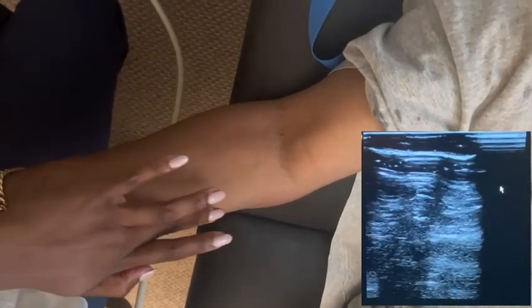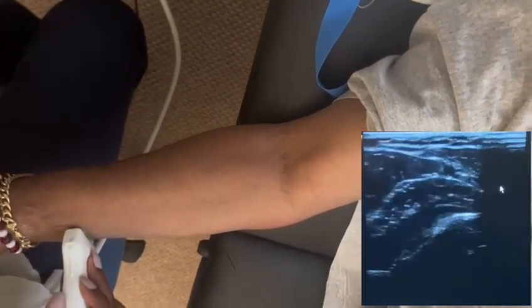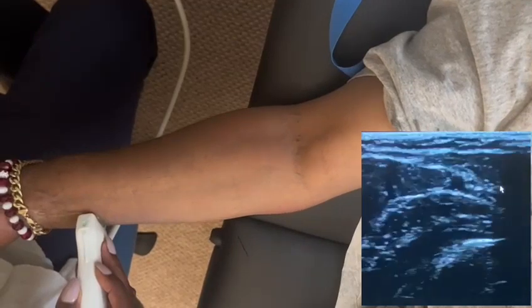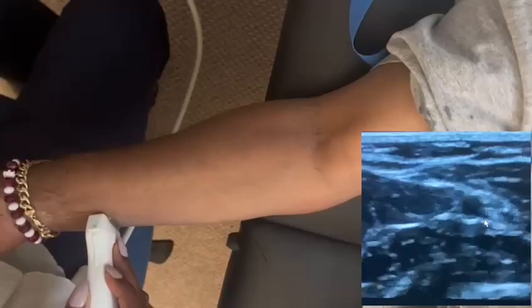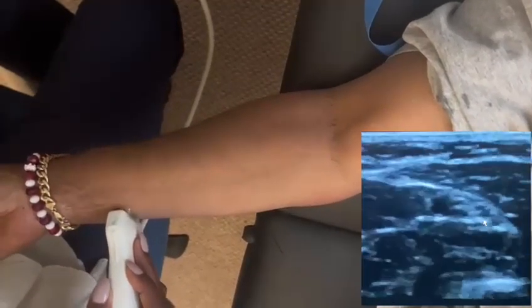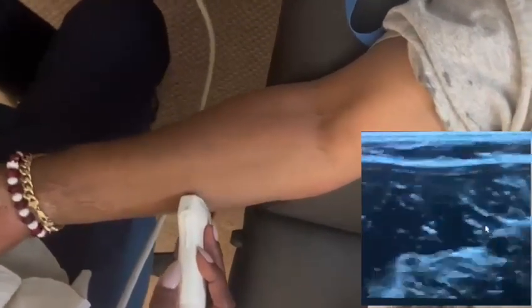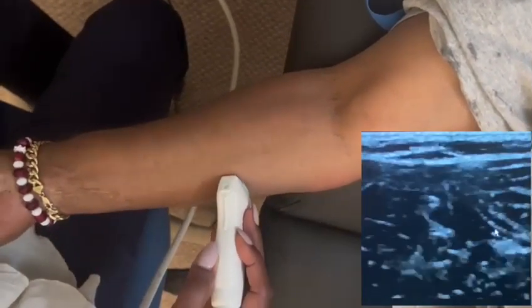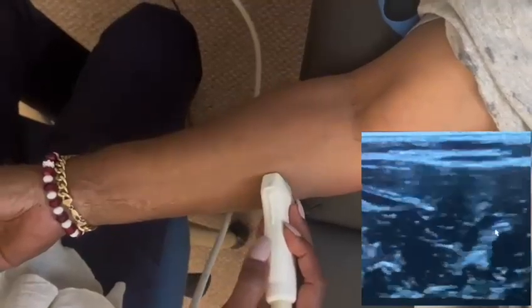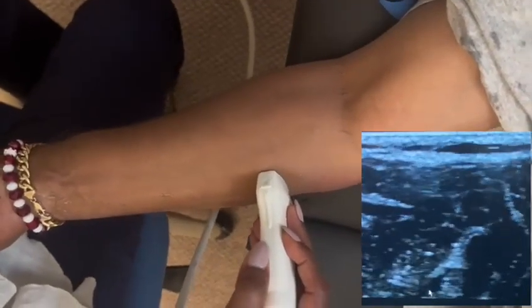Now looking at the ulnar vein — you should be able to follow this route to find it. As I put the probe right on the medial part of the arm, I can see the ulna. I'm going to follow it up towards the fossa. That's another good way to find this smaller vessel: go to the wrist and follow it up. As you go this way it goes deep, so I'll try to follow it at that segment.